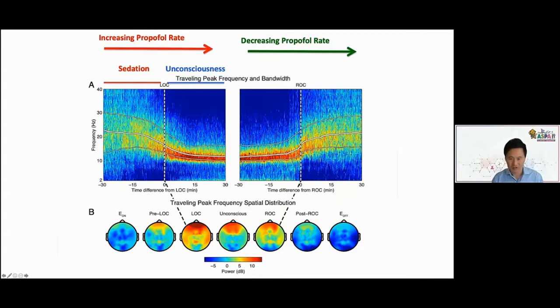So if you start to see the apparent center frequency of the alpha wave increase, then the patient is becoming more conscious. And again, hopefully intentionally. But it can happen with stimulation that can change.